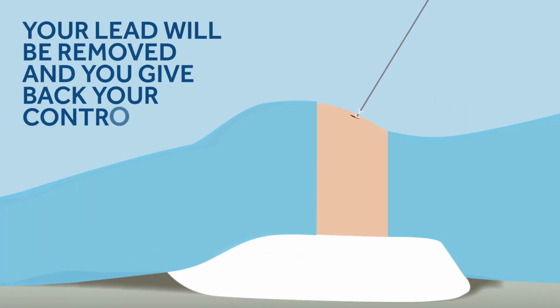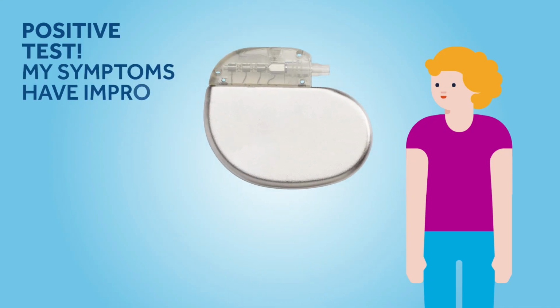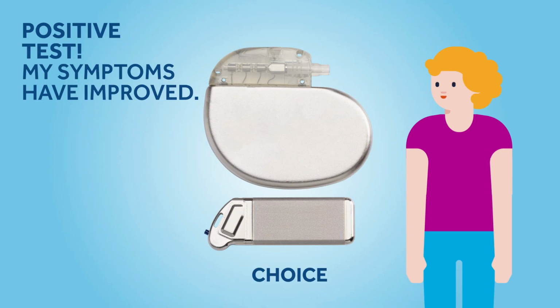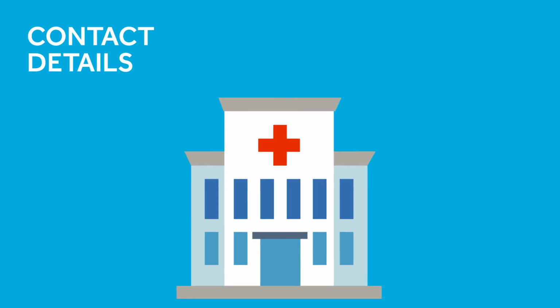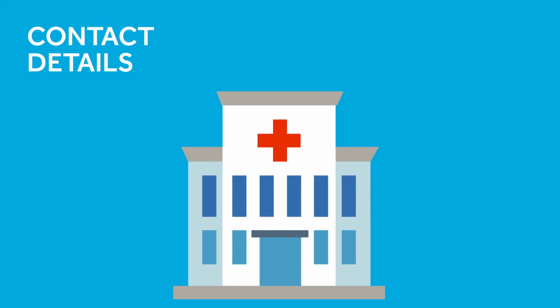If the test hasn't worked, your wire will be removed. Be aware that your symptoms will most likely return within a few hours after stopping the stimulation. If the test has worked for you, you will have a conversation with somebody in the clinical team to discuss next steps. Hopefully, this video has provided you with a helpful guide for the evaluation test phase.